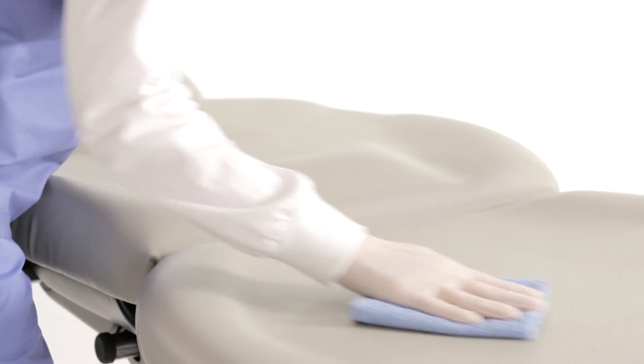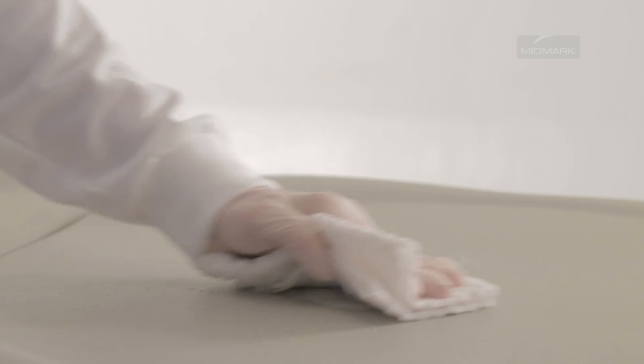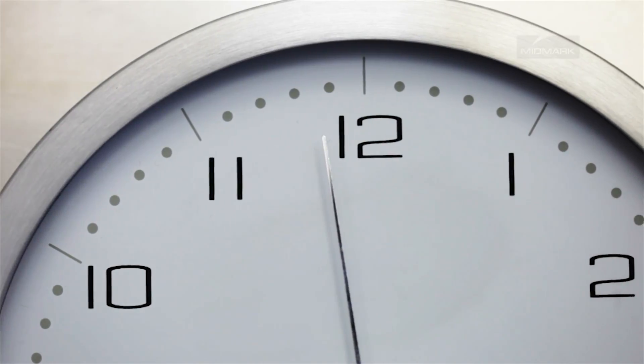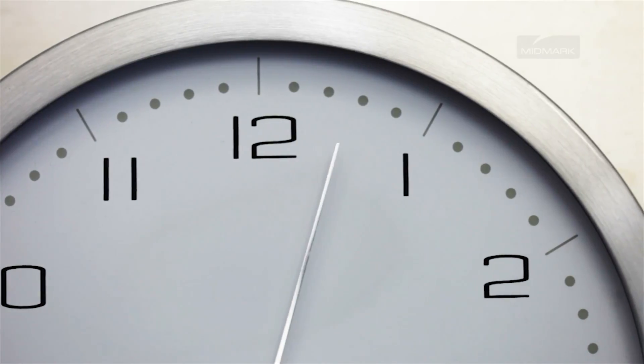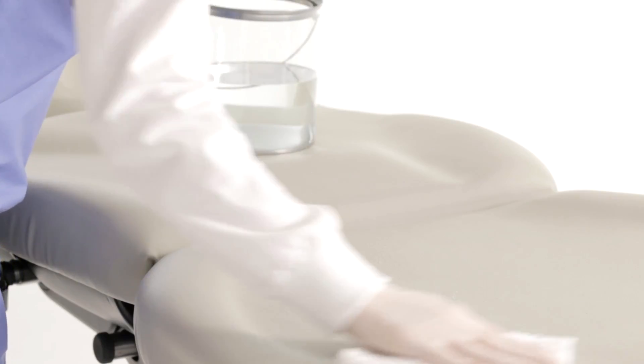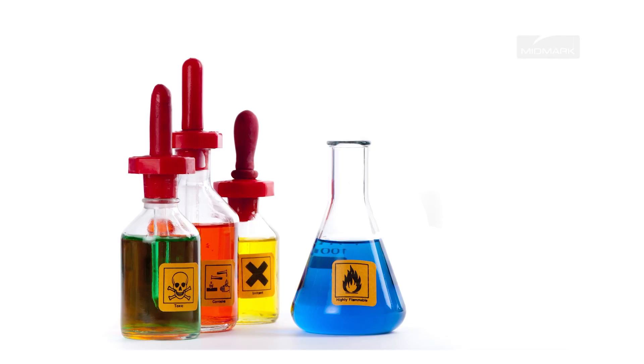To minimize disinfectant or cleaner residue buildup, do not allow disinfectants to pool on the surface. Once the approved contact time has been obtained, remove and dry any excess liquid remaining on the surface. We recommend that you wipe all surfaces with a clean, damp cloth daily. Do not use products containing quaternary ammoniums, as they will cause discoloration.